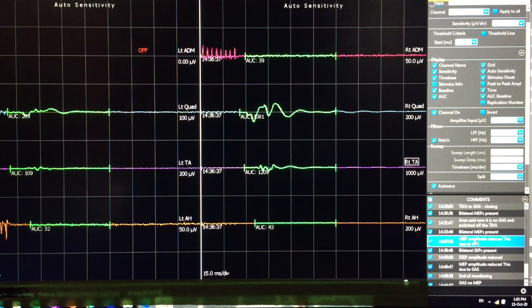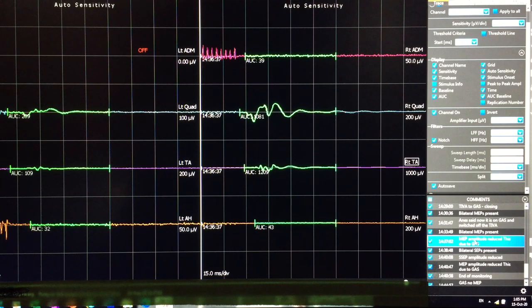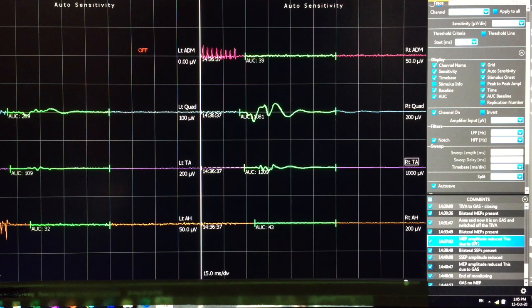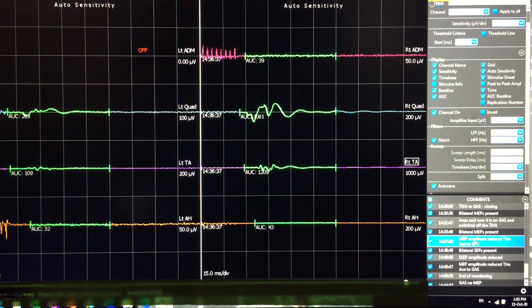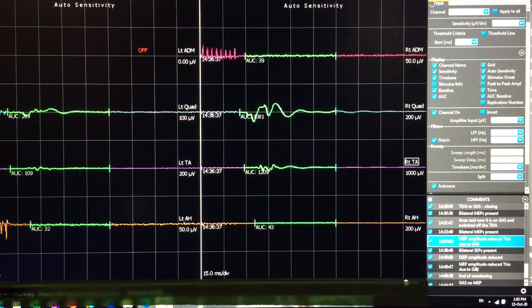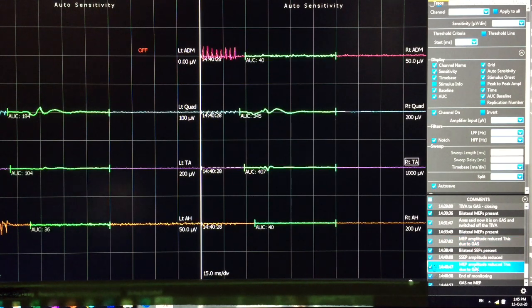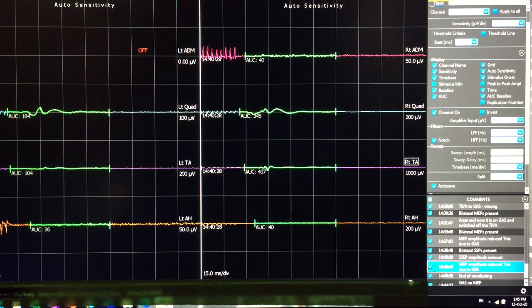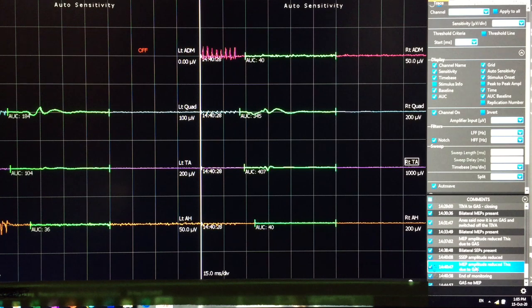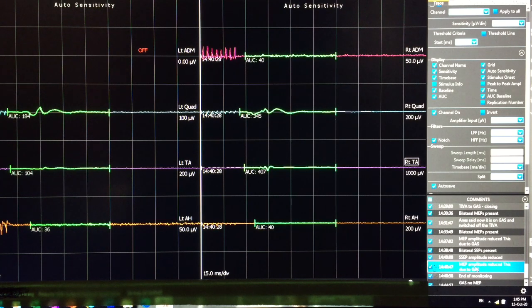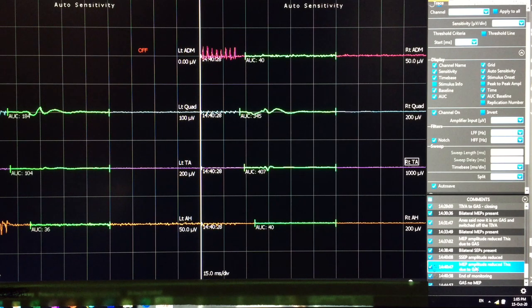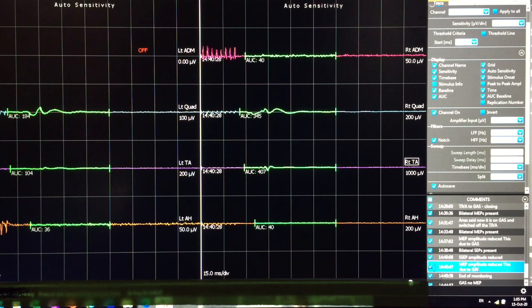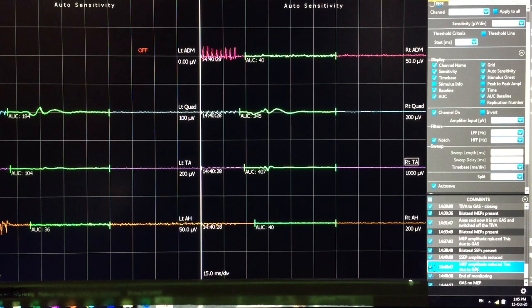And I made another recording around 1440. That is 10 minutes after switched off the TIVA and put the patient on gas inhalation anesthesia. Now you can see further reduction in the MEP amplitude.